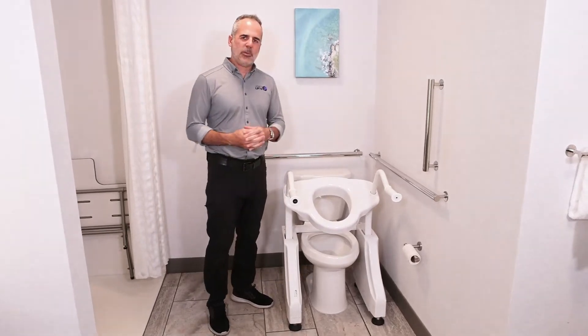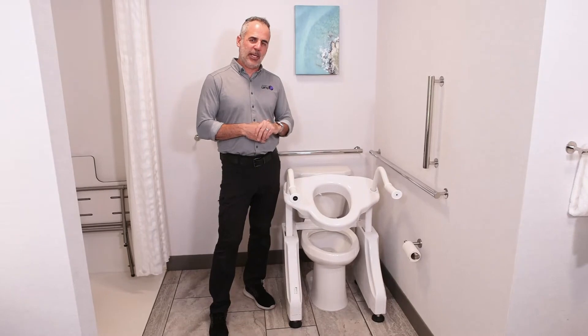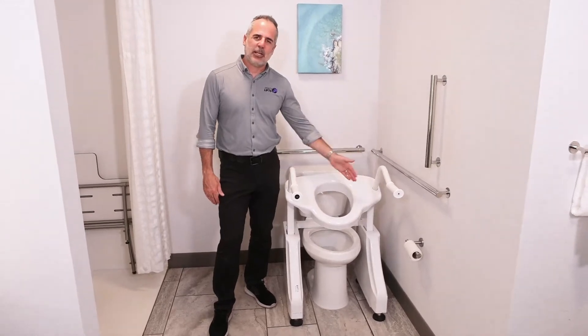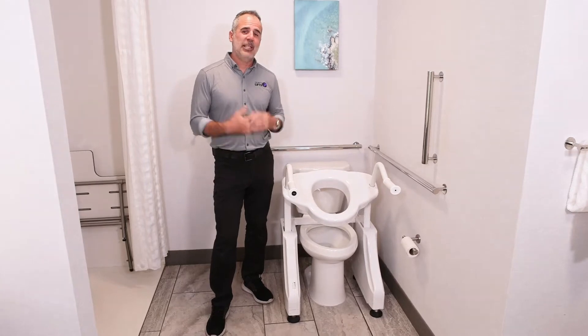It's just under 24 inches wide, which is building code for how big a toilet nook should be. Want to see if it'll fit in your toilet area? Measure from the center of your toilet 12 inches — one foot — in either direction, and if you don't bump into anything like a wall or a shower, it will fit.